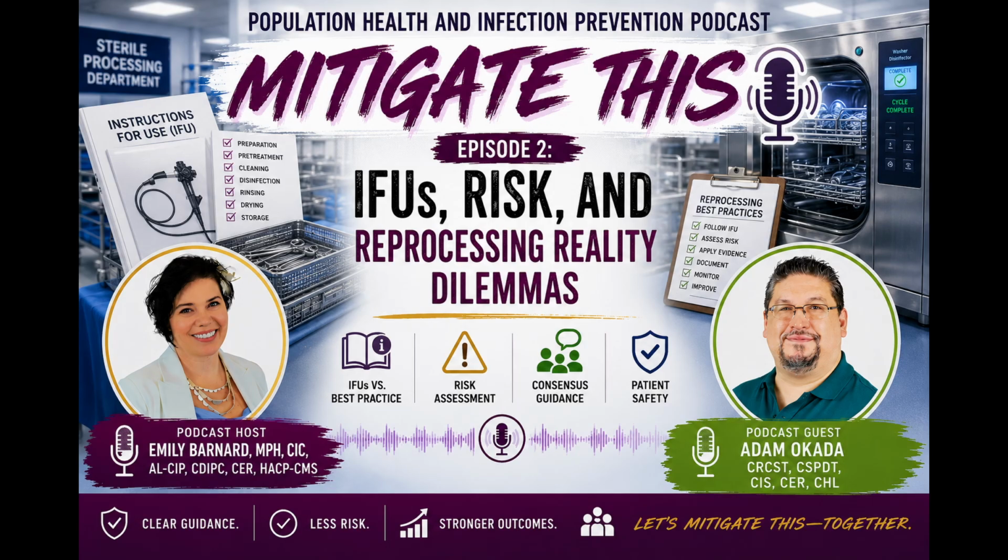And this extends beyond just cleaning steps. For example, some tabletop ultrasonic IFUs still call for the foil test, while there are more sensitive, validated performance tests available on the market today. So if there's an opportunity to standardize towards the higher, more rigorous practice when it safely covers a broader inventory of devices, does that create new operational or compliance challenges of its own?